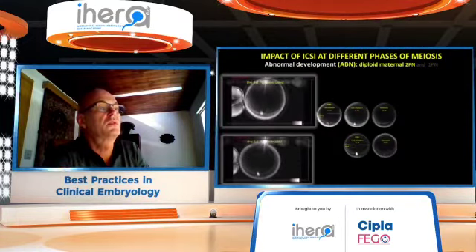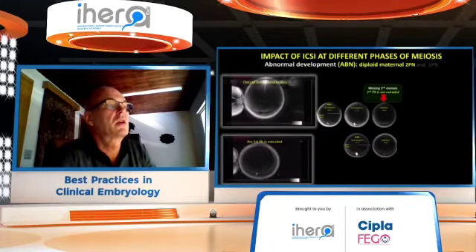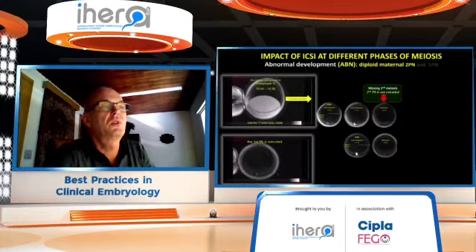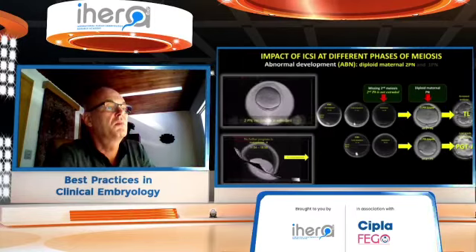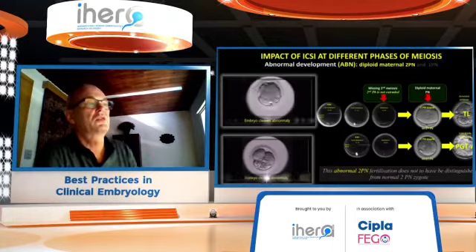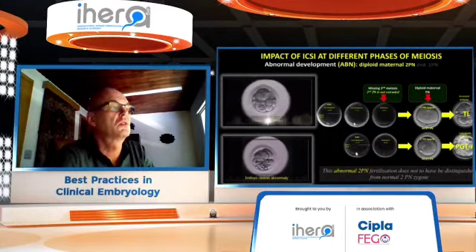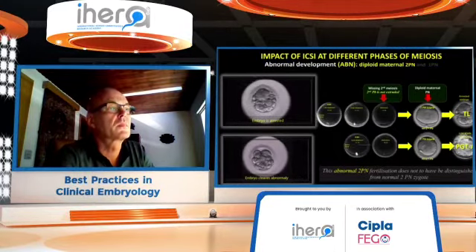Abnormal 2PN fertilization occurs when meiosis is not finished by extrusion of the second polar body, but proceeds directly to PN formation after interkinesis. Maternal PN was diploid, as confirmed by PGT-A. This abnormal fertilization cannot be distinguished from normal 2PN zygotes if you are not able to recognize a missing second polar body.